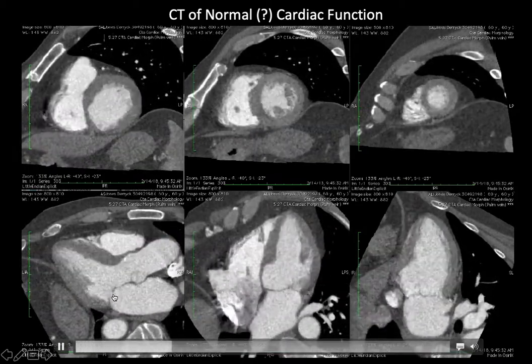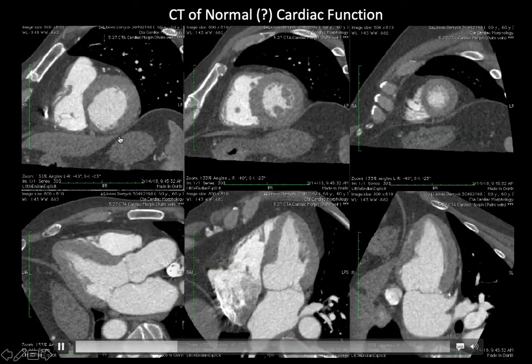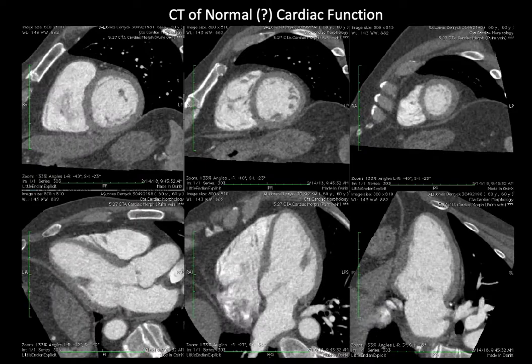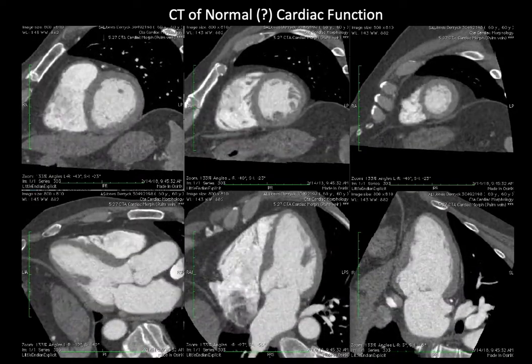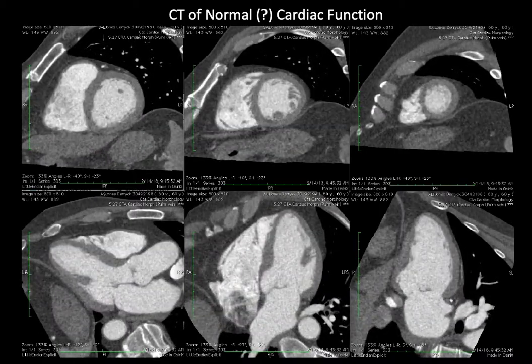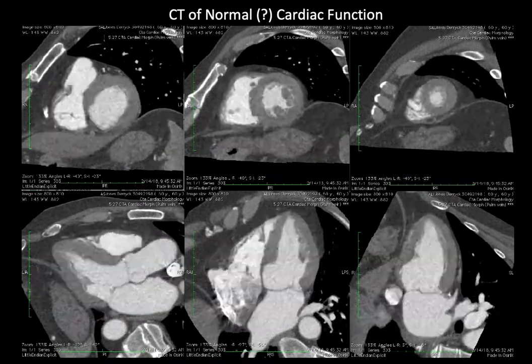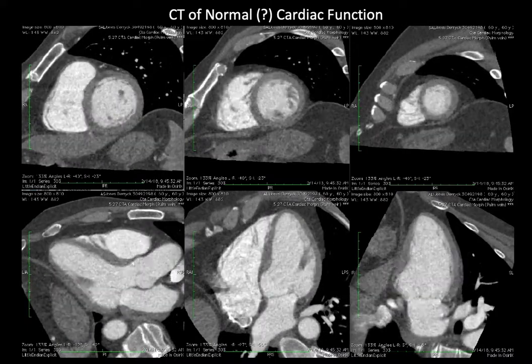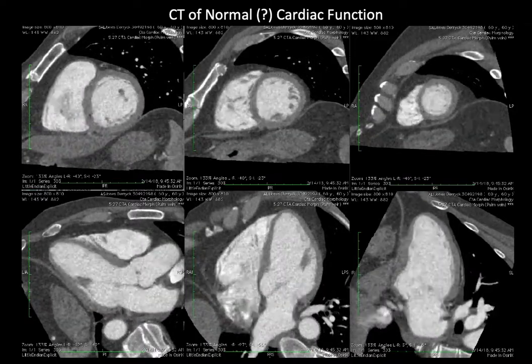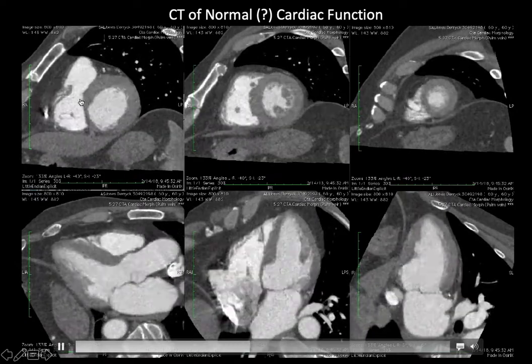One thing to be careful of is that at some point you're going to hit the aortic valve. So is that over here? If you keep going up, you're cutting, so these are 3 slices that are cutting like this. And so your top slice is basically somewhere in this area. So on this picture, where do you expect the LVOT to come out? At what o'clock? There's 12 o'clock, which is north, 3 o'clock. Where is the LVOT coming out on this picture? You kept going up. It'll basically split the RV. It's going to come out here.